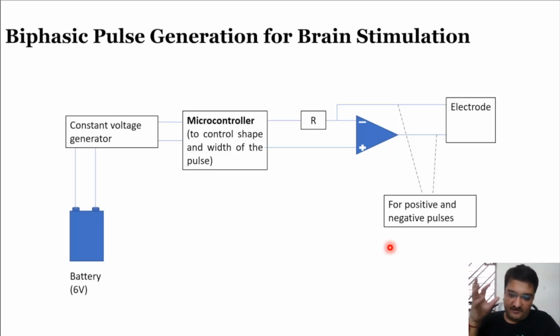A lot of applications exist, not only to check whether a person's sensory system works fine during the operation, intraoperative, but extraoperative as well, as in real life. As I mentioned, you can move a rat in a particular direction. Similarly, you can place a micro camera on the rat's head and move it. You can use it for spying purposes or any other thing.